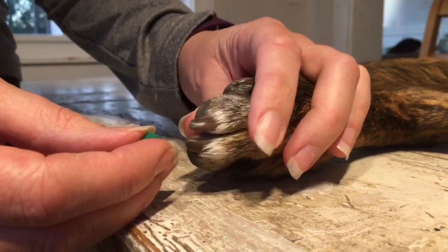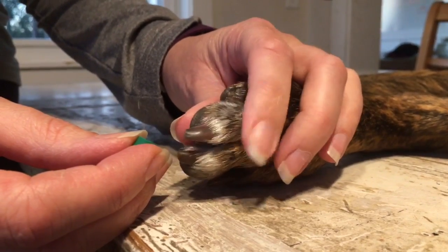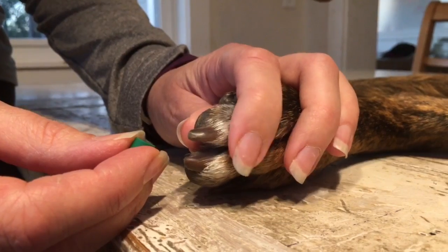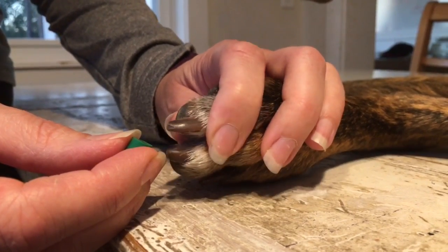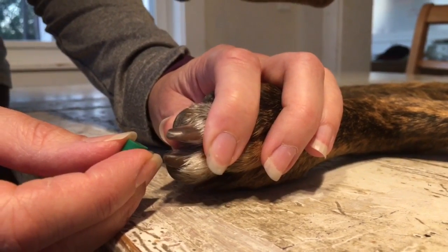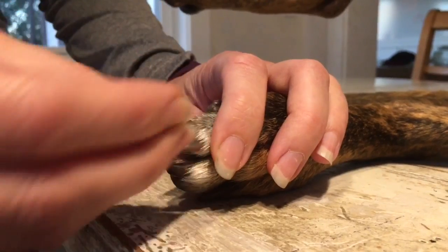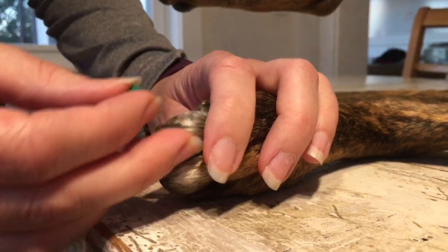The first thing you want to do is stabilize the toe, similar to how you would press a cat's claw to extend it. I'm not putting excessive pressure that's causing the dog any discomfort. This is my dog, Luke — he's just laying peacefully here on the table. I'm stabilizing it with just gentle pressure, so that when I go to press the toe grip on, I'm not torquing into the toe itself, which for a senior dog with arthritic toes could be painful.